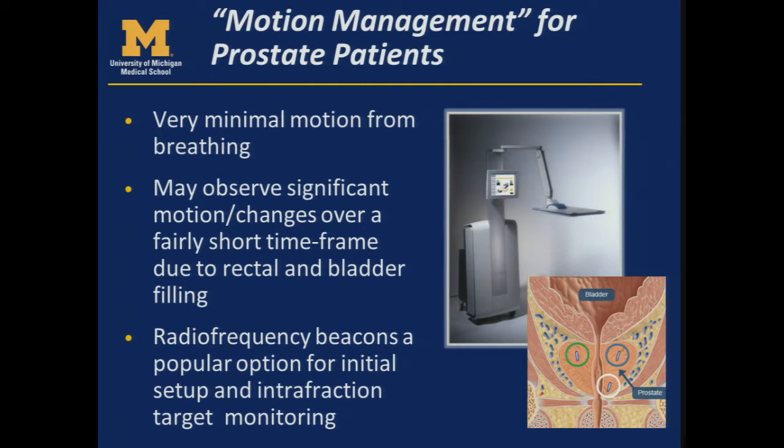So I put motion management here in quotes. Of course, we're going to see very minimal, if any, breathing motion in the prostate. However, there are a lot of other types of motion that you see. You can see significant motion or changes over a pretty short time period with prostate patients due to rectal and bladder filling and changes.